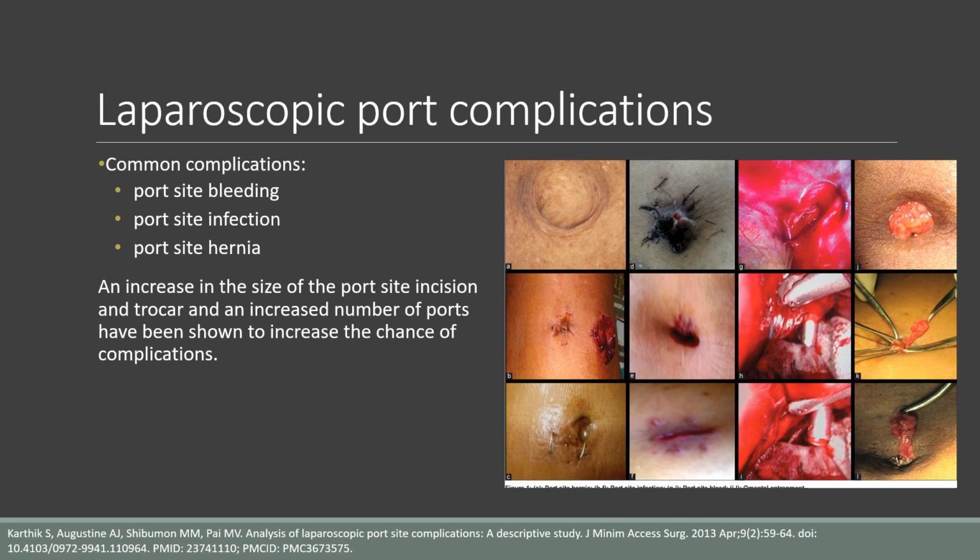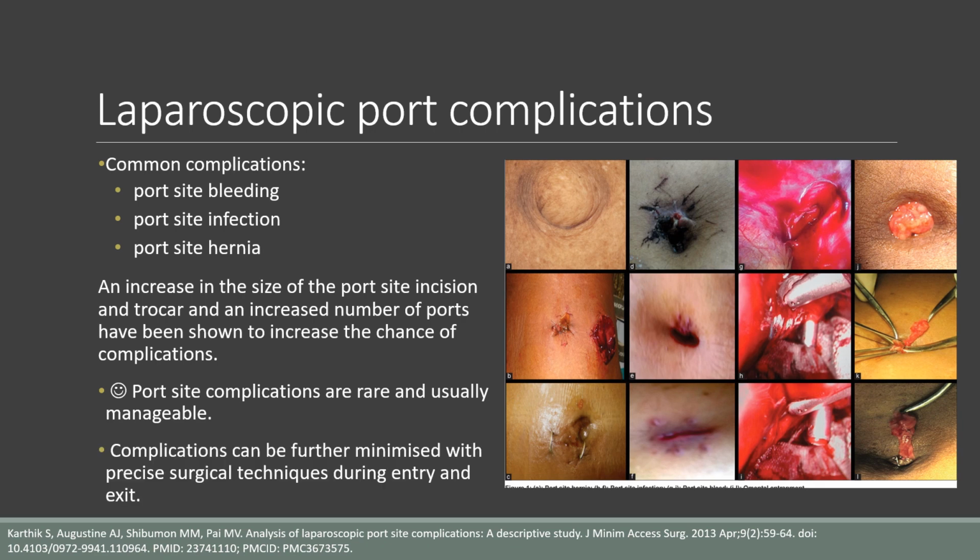However, on the bright side, port site complications are actually very rare, and if they do occur, they're usually manageable and don't cause too much discomfort. We can further reduce these complications by using precise surgical techniques during entry and exit, and being very mindful of our laparoscopic port site placements.